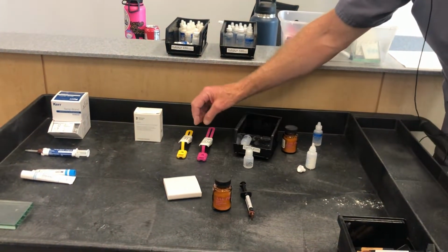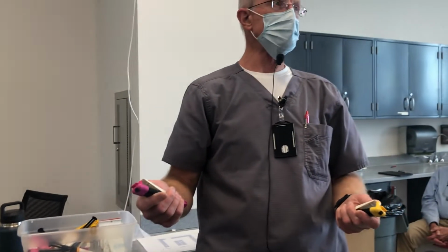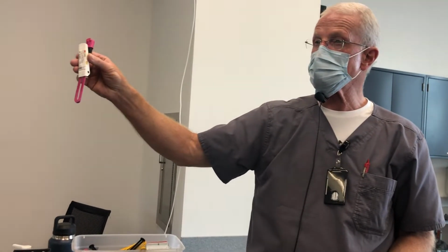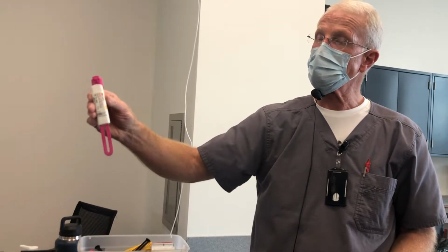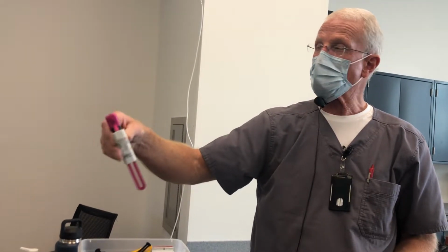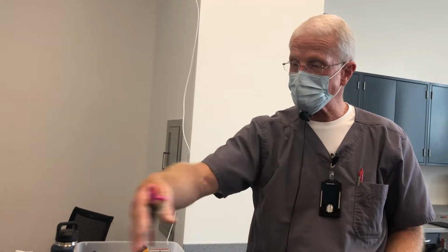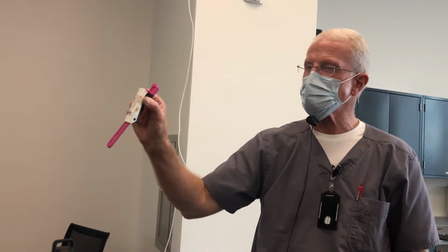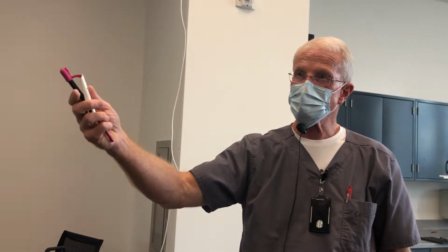The ones that you're going to be using mostly, and these are 3M's brands, are RelyX Luting Plus, which is a resin-modified glass ionomer. So it's resin-based, but it's been combined with glass ionomer. Now, why would they do that? Fluoride. Fluoride release over time, sustained fluoride release. You don't get any better bonding, but this is kind of my go-to when I'm cementing zirconia crowns now, because of the fluoride in them. I'll use RelyX Luting Plus.